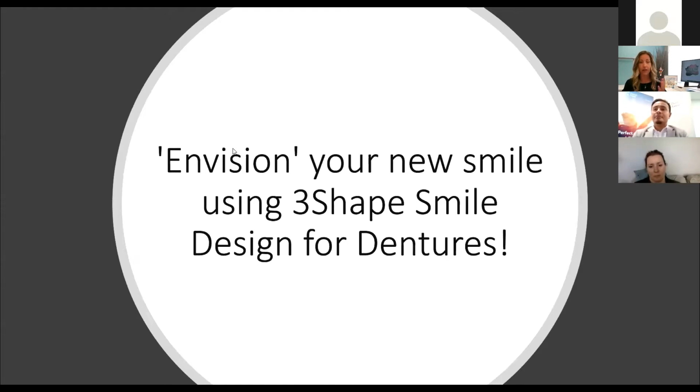So I have about a 15-minute presentation with some slides on my digital journey. And I think it's always beneficial to show you some real cases that we've been working on. I will ask that you keep the questions towards the end, and I'm happy to answer what I can. I definitely won't have all the answers, but we will find somebody that will. So I'm going to get started here. Hopefully everything runs smoothly. This is my first presentation, so please just bear with me if I say too many ums.